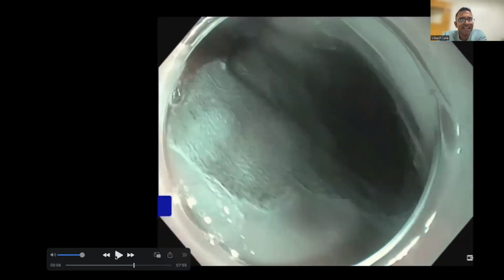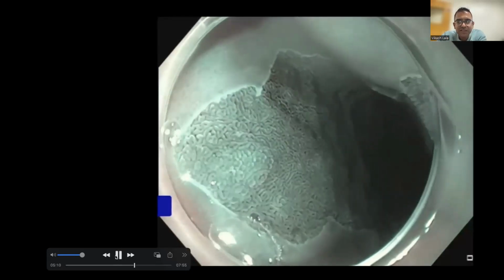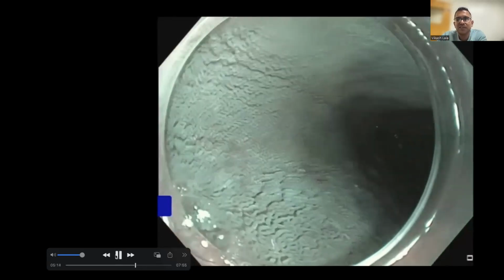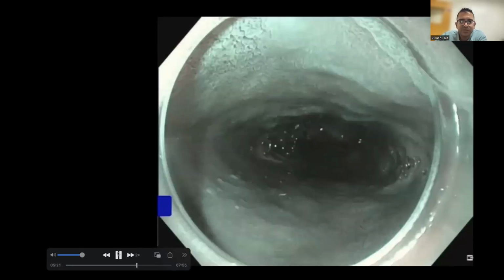And this is something that I love doing. It's not so much in the guidelines, but I think there's really good value in combining acetic acid with NBI. And look at the images that you get when you're doing that. You beautifully see mucosal patterns and vascular patterns. So I'm going to skip a little bit forward here for the interest of time. So I'm just fast forwarding there.